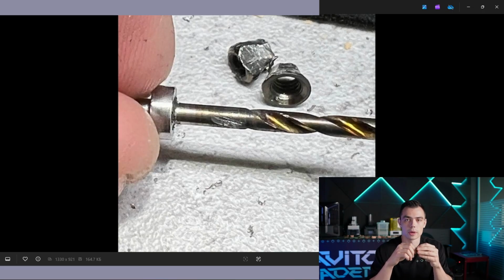When you have finished the post-fabrication of your surgical guides, it's a good idea to check every sleeve for normal insertion. In this picture you see an example of a sleeve which was not tested before the surgery, and you see that the drill got stuck during the drilling and welded with the sleeve.